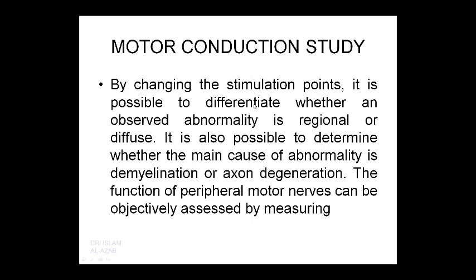By changing the stimulation points, it is possible to differentiate whether an observed abnormality is regional or diffuse. It is also possible to determine whether the main cause of abnormality is demyelination or axon degeneration. The function of peripheral motor nerves can be objectively assessed by measuring this.